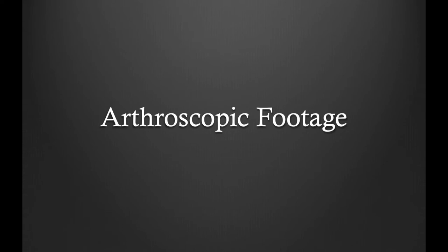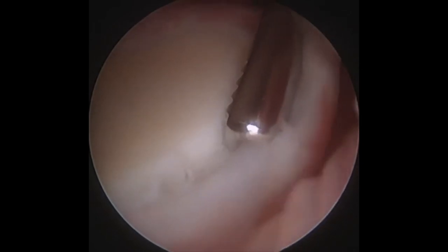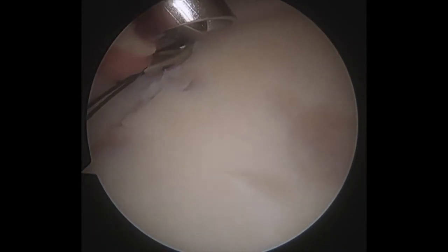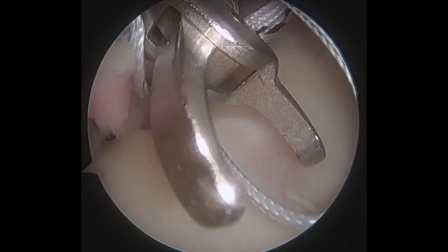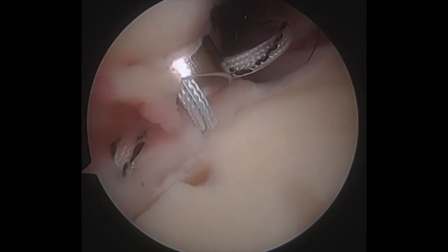This is arthroscopic footage of a SLAP repair I performed. This is a left shoulder viewed through a posterior viewing portal. I am using my shaver to debride the unhealthy tissue between the labrum and the glenoid. Now viewing the same shoulder from an anterior portal, I use a suture passing instrument to pass the suture through the torn labrum. These procedures are all performed arthroscopically through three small incisions. I then use a retriever to retrieve the suture, followed by a shuttling technique to shuttle high-strength suture, called fiber wire, through the labrum.